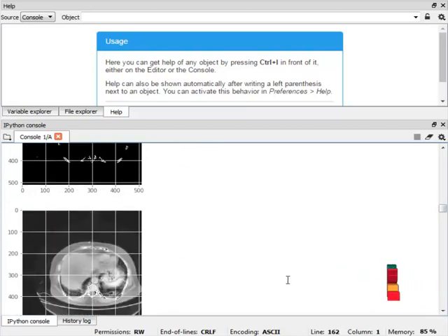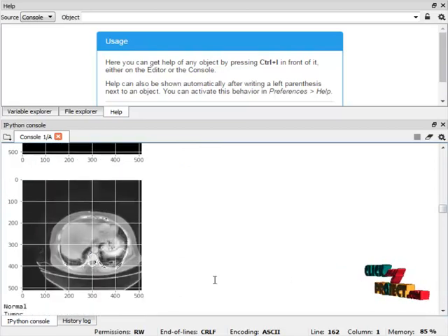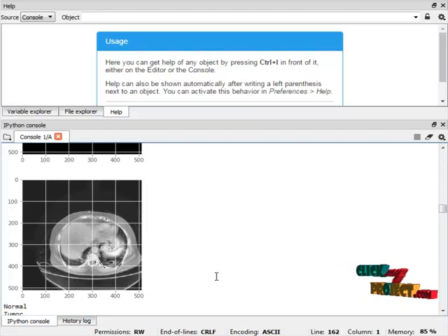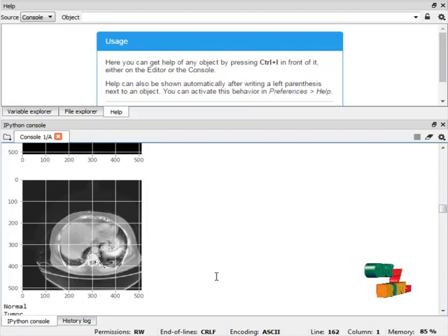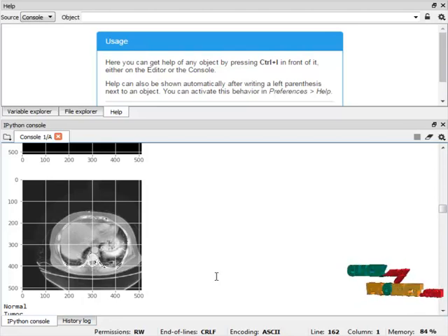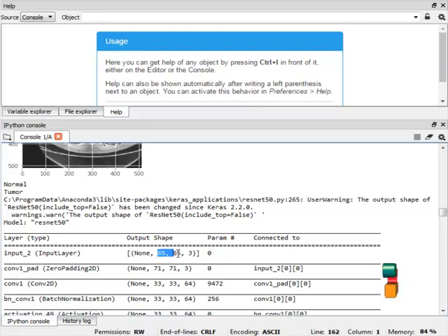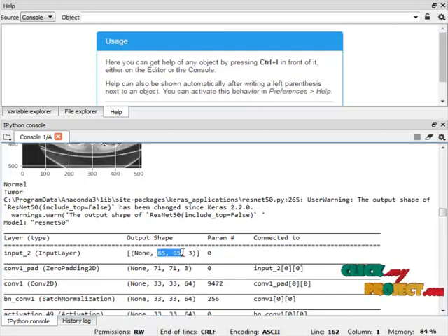After reading sample images, the CLAHE filter is applied. The CLAHE filter increases the contrast of the input images. It is implemented as a function and applied in the data pre-processing step, where all images are read, the CLAHE filter is applied, and images are resized to 65×65 pixels to assist the prediction method.